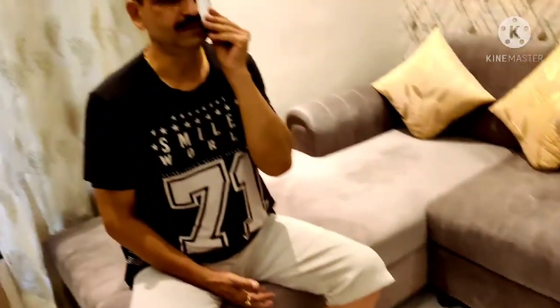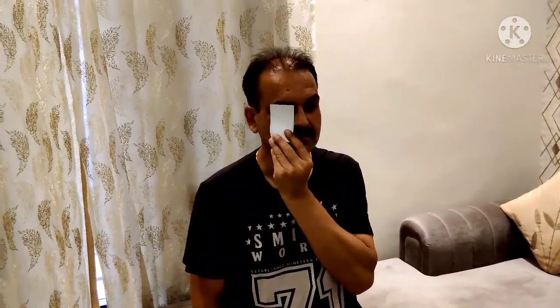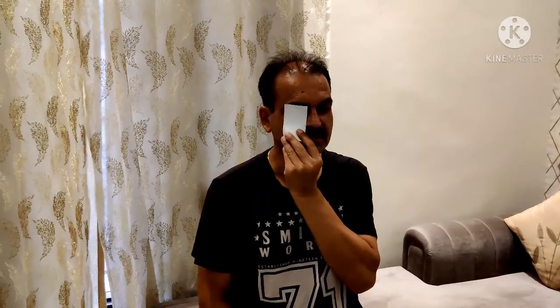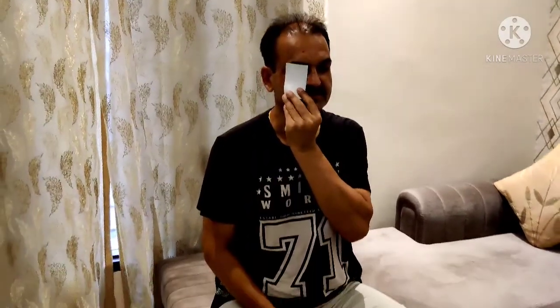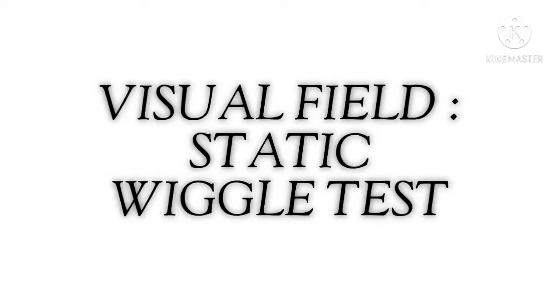A patient who cannot read the largest letter should be positioned closer to the chart. Note the intervening distance. Identify the smallest line of print where the patient can identify more than half the letters. Record the visual acuity. Visual acuity is expressed as two numbers. The first indicates the distance of the patient from the chart, and the second the distance at which a normal eye can read the line of letters.